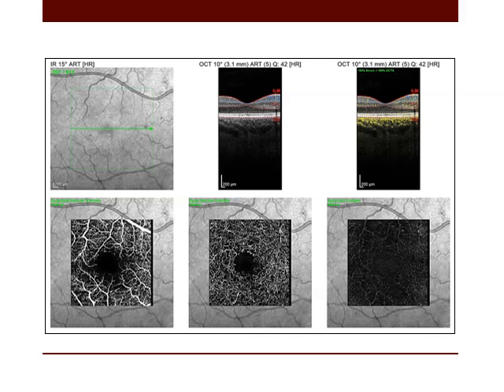There are many disadvantages. However, the most undesirable disadvantage is that the blood vessels could have motion in them, but less than the device capacity to detect it. So they are projected black while they have motion.